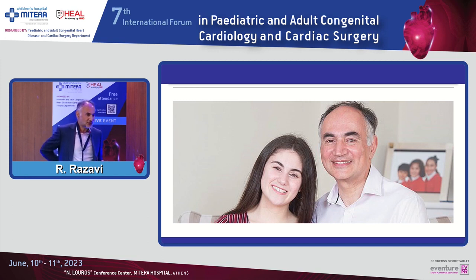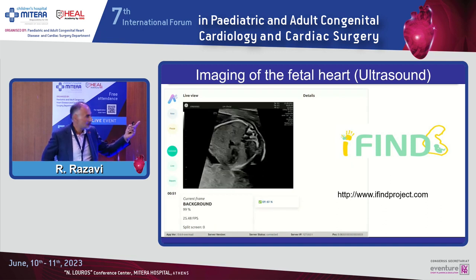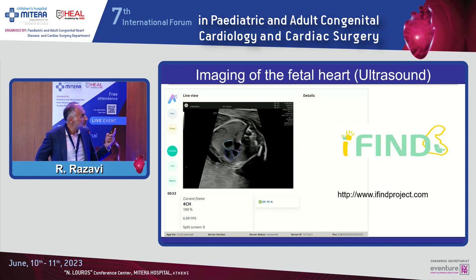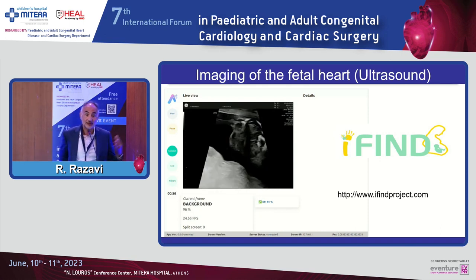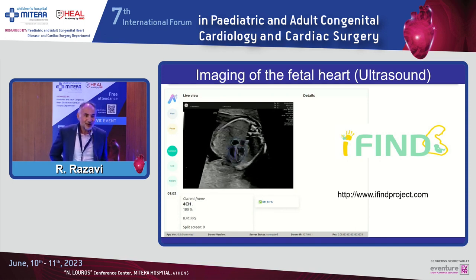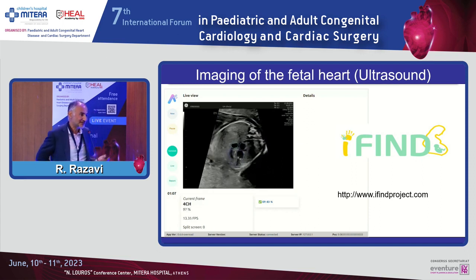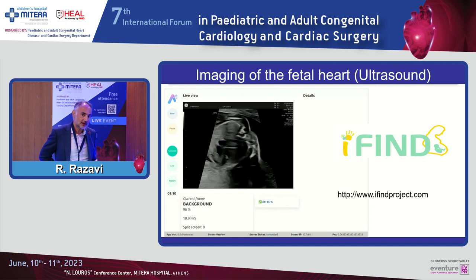But that was a motivation, not just for our patients, and many of our patients come to us when they are very sick because they haven't been antenatally diagnosed, to do better. So we got a project funded called iFind, and it's much wider than just the MRI work I'm going to show you. It includes fetal echo, and here is some data, again using machine learning, where in real time, as you're scanning, you can identify the chambers you're looking at and even diagnose the diseases. This will help the people who do those scans, not the expert fetal cardiologists sitting in front of me, but the non-experts, to properly diagnose these problems.